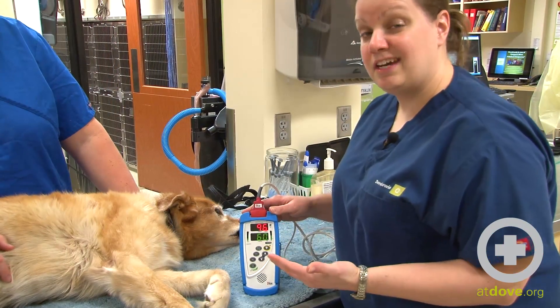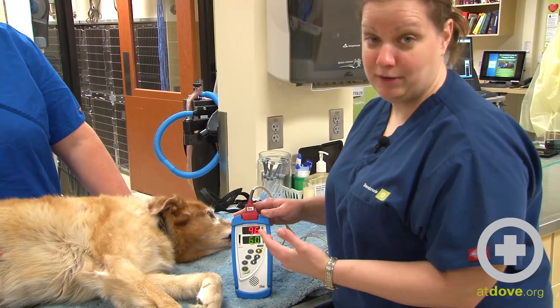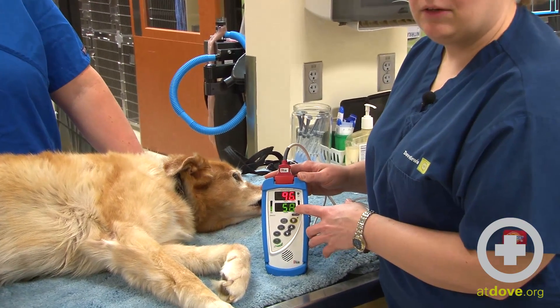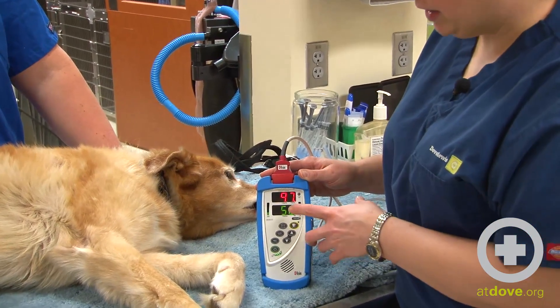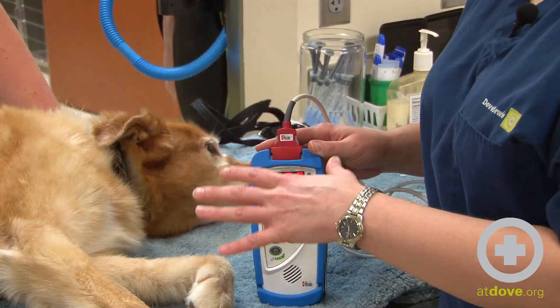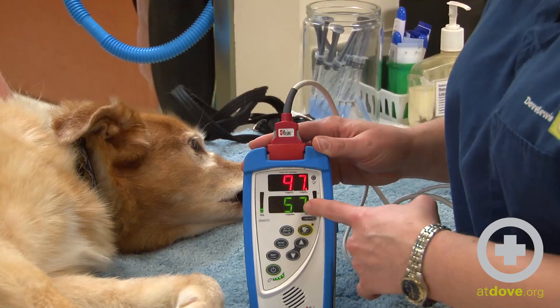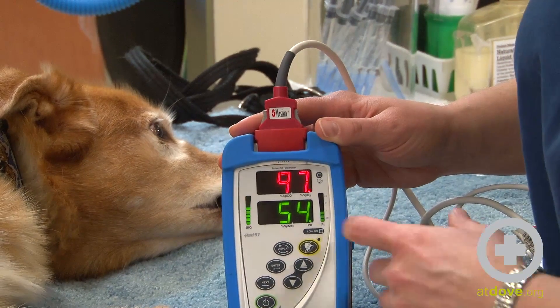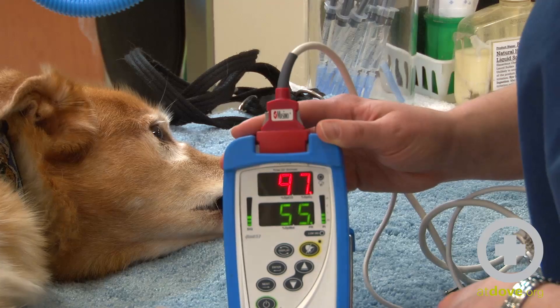It's good to give it a good 10 to 15 seconds to kind of get its bearings and give you a reading. The bottom number here is going to be her pulse rate, and in order to make sure that this machine is actually reading what it should, I need to know what her pulse is and match it to this number here. When I took her pulse it was right around 60 beats a minute, and so this is reading right around 60.